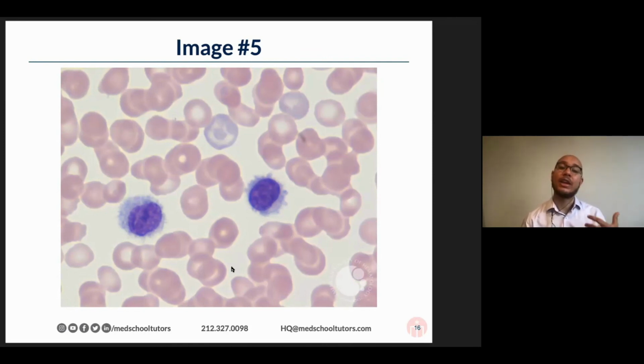But there are false positives for rouleau, which is that sometimes it's the way that the slide was prepared. And if there's another finding on the blood smear that is screaming another diagnosis, I wouldn't get sidetracked. And I only say that because most folks in the chat are chiming in with the correct diagnosis here, which is, of course, hairy cells, which is pathognomonic for hairy cell leukemia.